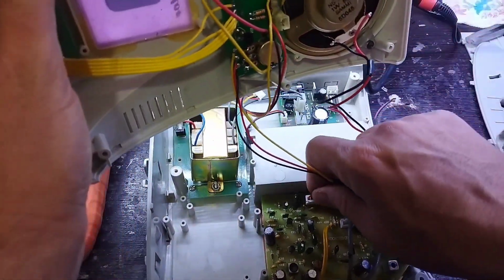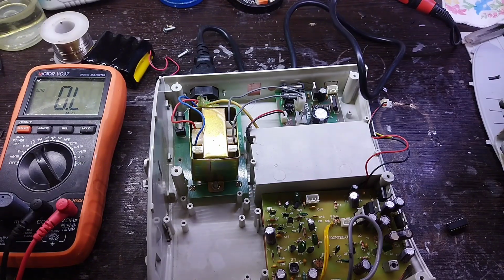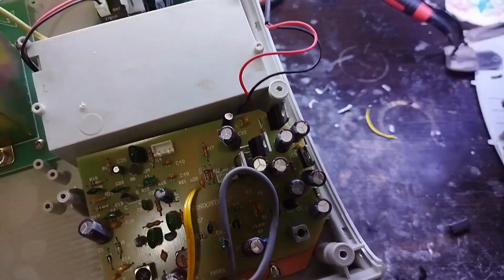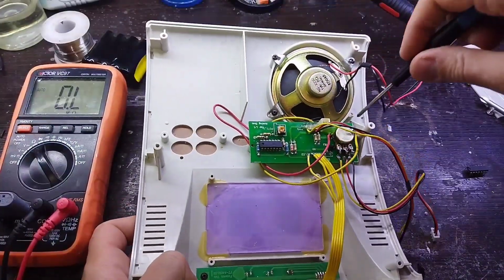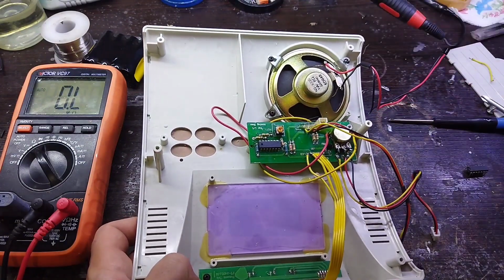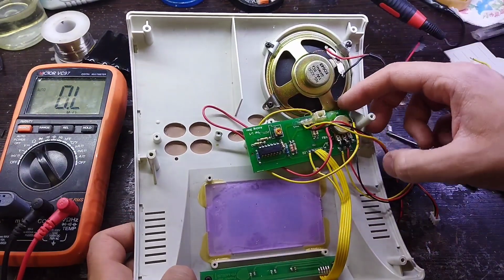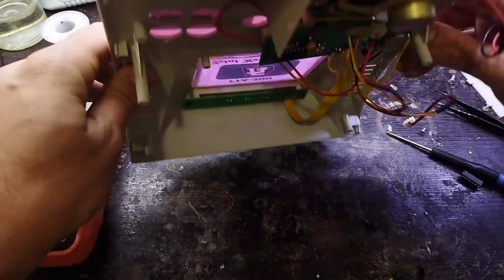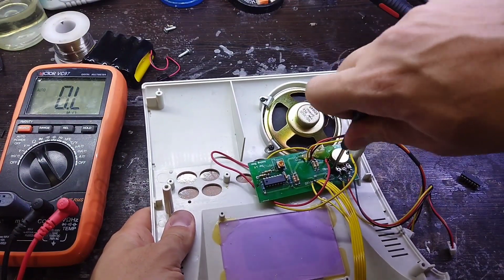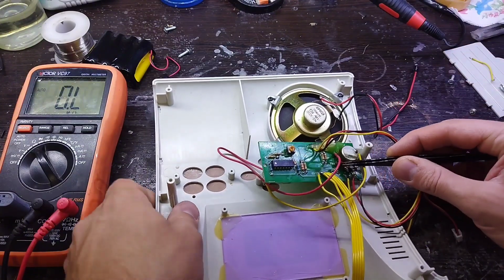This device is mostly used in the offices of obstetricians and gynecologists, but it is also used in hospitals. SONOKID is also one of the necessary equipment in the midwife's office. This device is based on Doppler theory. It works by means of a piezoelectric transducer probe, which is related to an ultrasonic system. In fact, the SONOKID device reflects the sound of the fetus's heart, which can be heard through the speaker of the device. The SONOKID device does not emit any harmful radiation waves. For this reason, using it is not dangerous for the mother and the fetus.